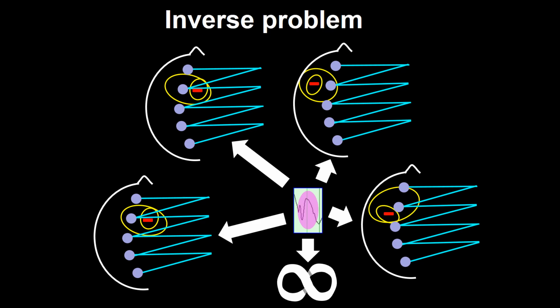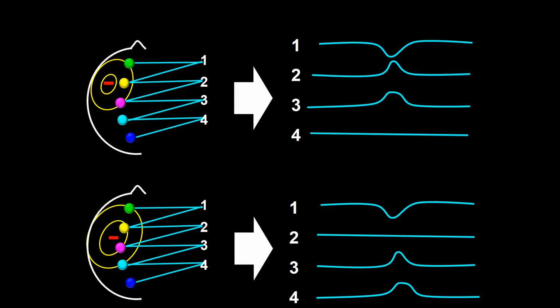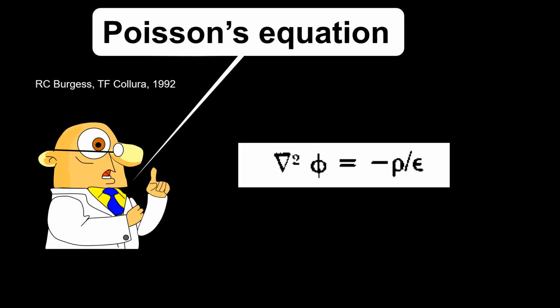On the other hand, were we to know all the qualities and configuration of a voltage source or generator and the medium between the generator and the capturing electrode, we would be able to correctly predict its EEG electrical event representation. This is called the forward problem. The forward problem, as I just told you, has a unique answer. The forward problem can be resolved using the Poisson's equation.